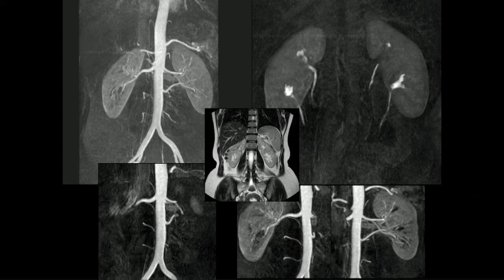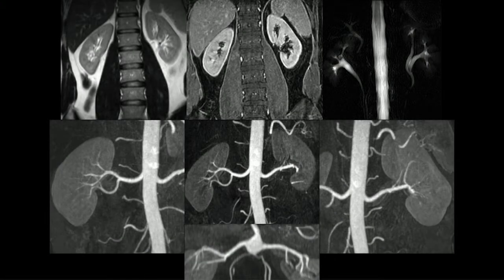Not only the veins, but the ureters. If you've got 2 ureters, the transplant surgeon is not going to want to take out that kidney, because that's 2 ureters they're going to have to anastomose to a bladder. There's 2 ureters that are very small and fiddly, and they're more likely to necrose or stenose, so they don't want to take a kidney that's got 2 ureters. So we need to look at not just the arteries, not just the veins, but also the ureters. So we need some comprehensive protocol that looks at all of these things in a good way.